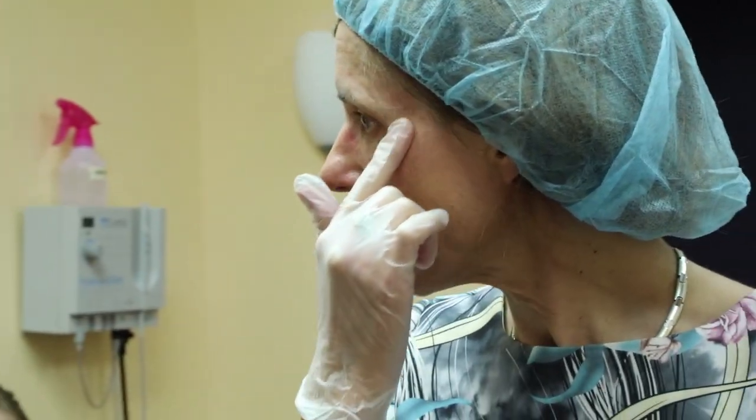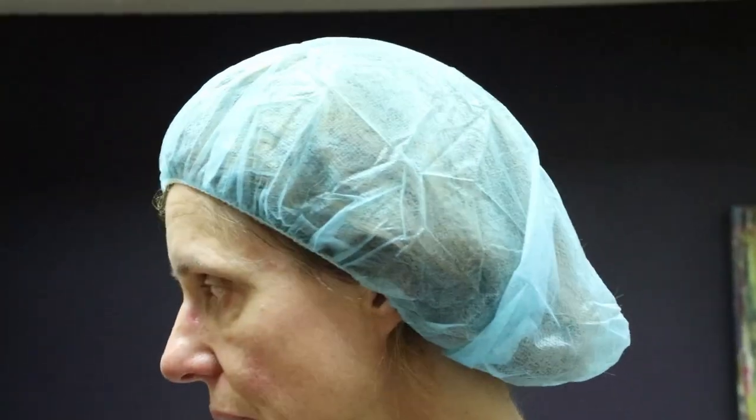You want to be particularly sure that you have it all the way up to the orbital rim — down here over the bone. You do not go into the actual lid portion. You do not apply it to the upper lid. You do not apply it unless specifically instructed onto the vermilion border or the lip. Now you have even activation.